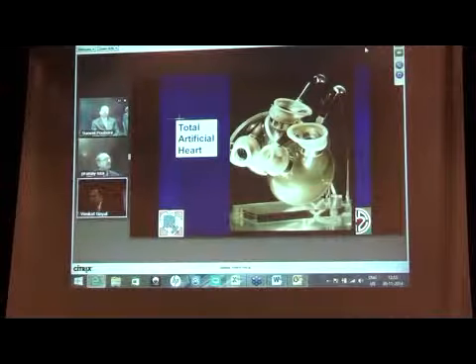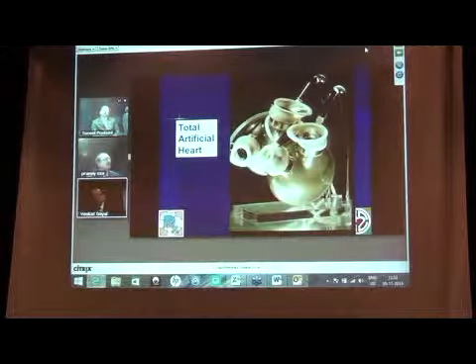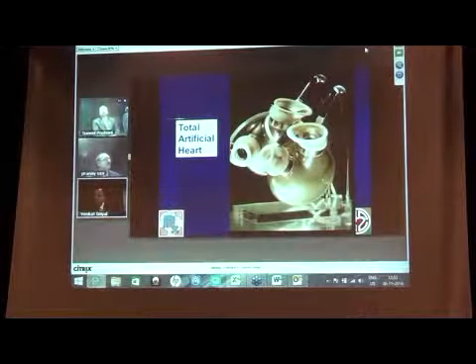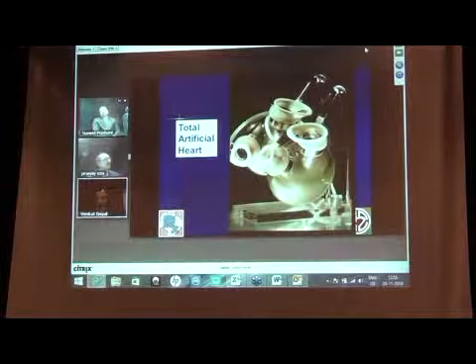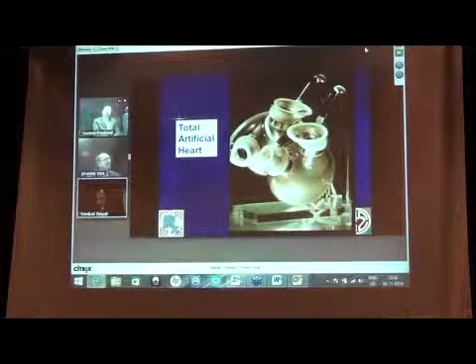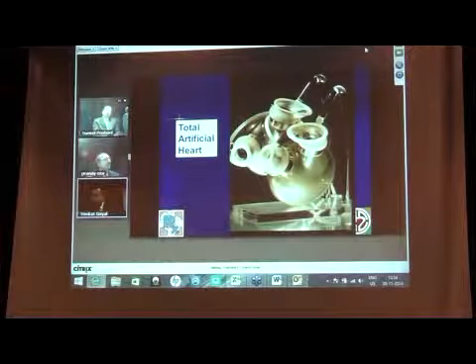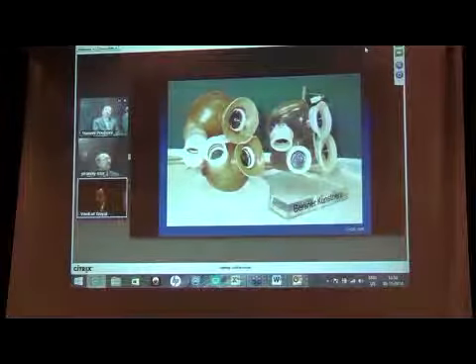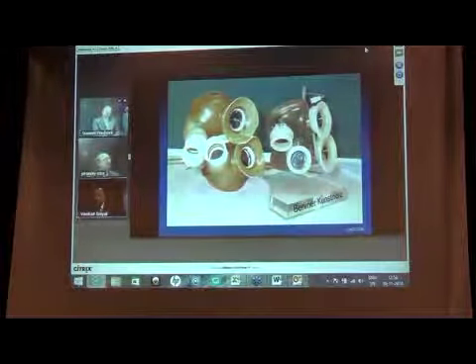Then a problem started when, in between, the right ventricle would give in. Suddenly managing a right ventricle also with the artificial device was not possible. So they came up with the idea of a total artificial heart. In this total artificial heart, all the 4 valves are the valves that we have in our rheumatic disease patients. So there are 4 cardiac valves and 2 pneumatic chambers. This entire thing has to go inside the thorax of the patient, almost the size of the thorax. These were the initial few pictures of the total artificial heart: 2 pneumatic devices, 4 artificial cardiac valves.